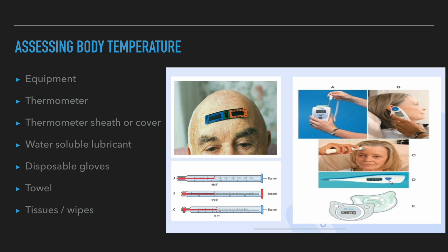Measurement of temperature over the temporal artery does not require contact with mucous membranes, but the head must be uncovered since bandages or clothing will trap heat. Also, moisture on the skin can affect the accuracy of measurement. 4. Disposable paper, chemical thermometers. Single-use paper thermometers are thin strips of chemically treated paper with raised dots that change color to reflect the temperature.